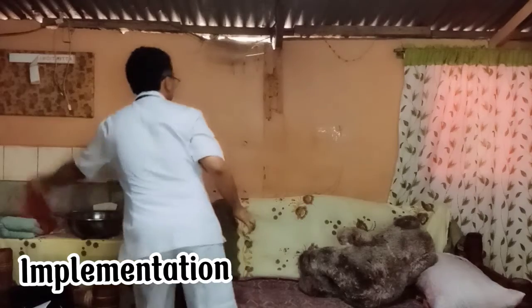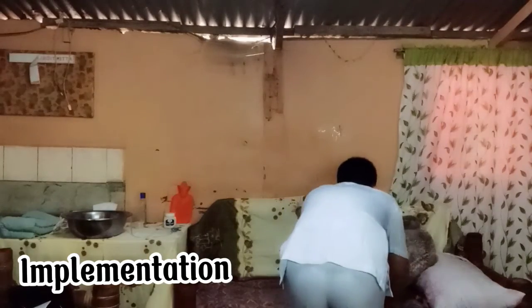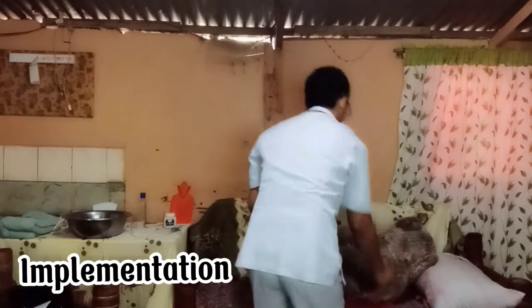Then I'm going to place the linen saver pad here at the buttocks. Make sure that you expose only the area where you're going to examine.